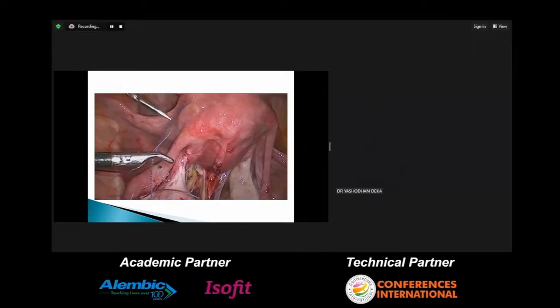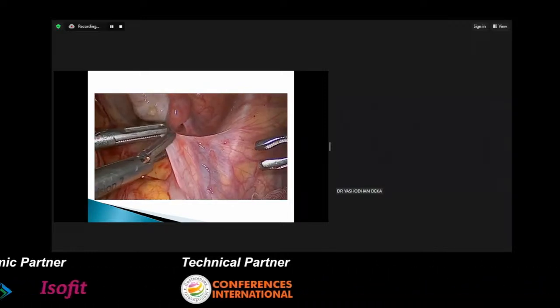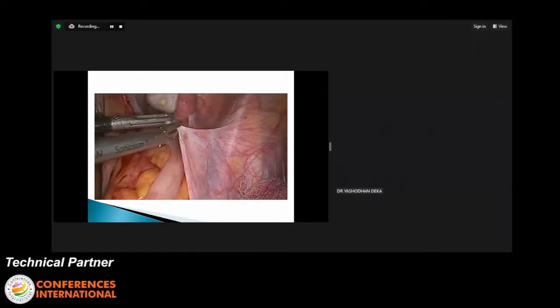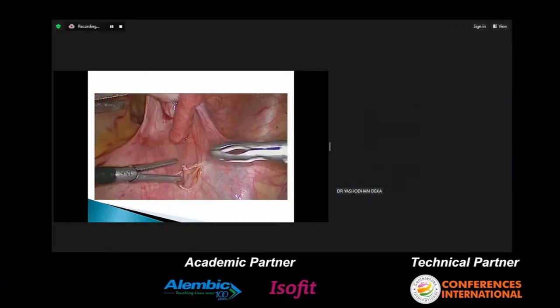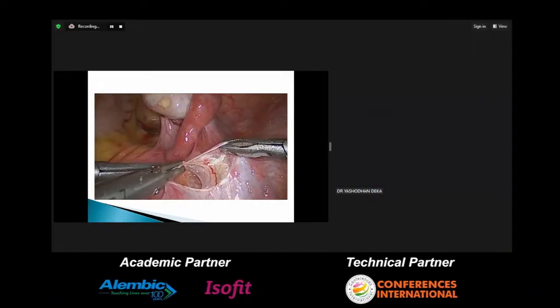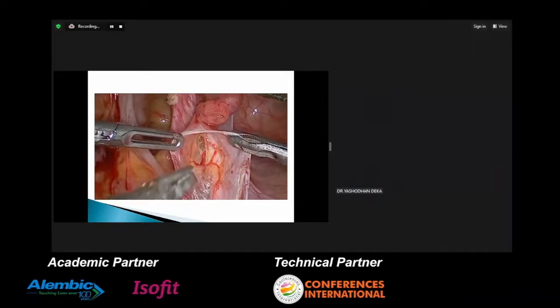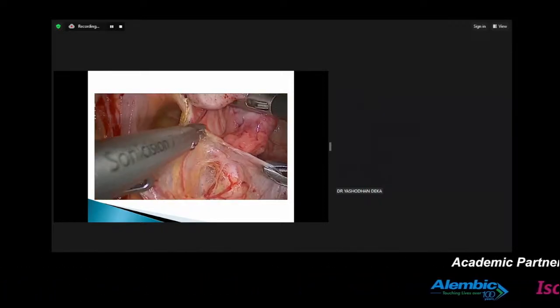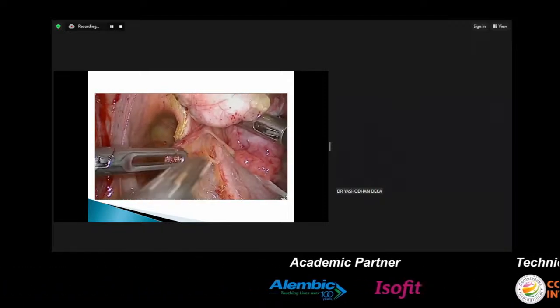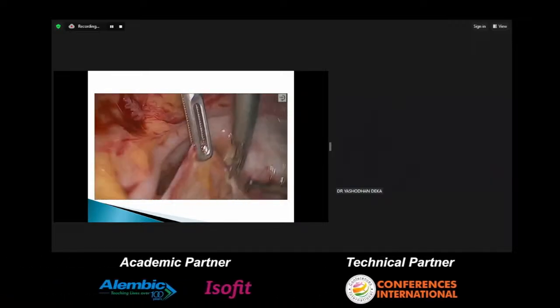You can use a T-lift. We use a simple port closure to do that. Similar steps are repeated on the opposite side. But of course, the ergonomics change a bit because you're on the opposite side. And since we're an ipsilateral surgeon, make a small hole in the pelvis and let the carbon dioxide enter. Once you do that, just nick the peritoneum with the tip of your instrument, any harmonic scalpel that you're used to, identify the ureter, and lateralize it completely because it has to be away from your field of dissection. Keep going, lateralize it completely, and then you again develop the pararectal space.